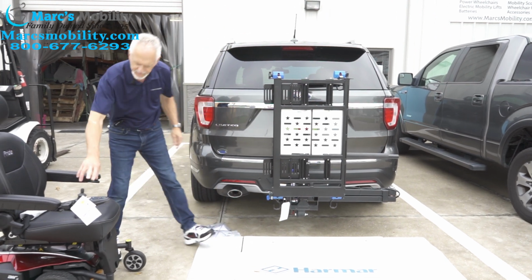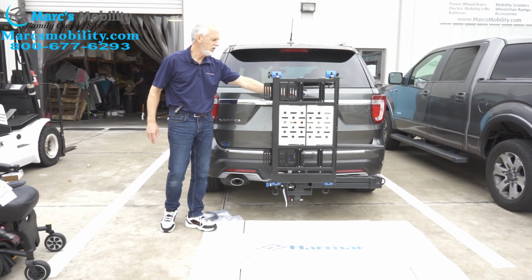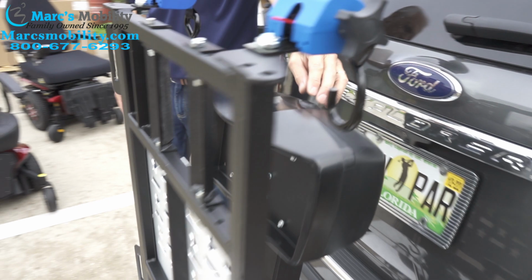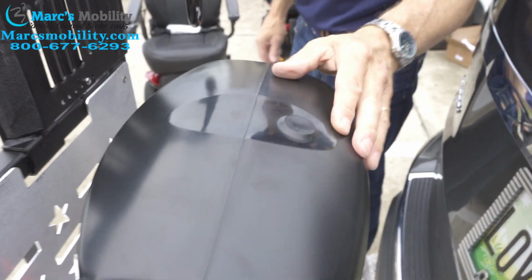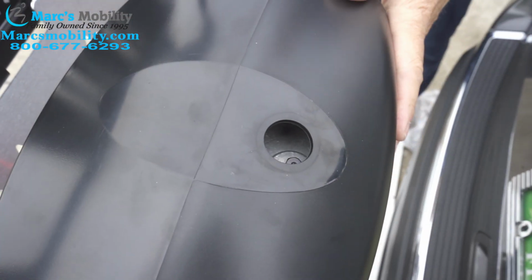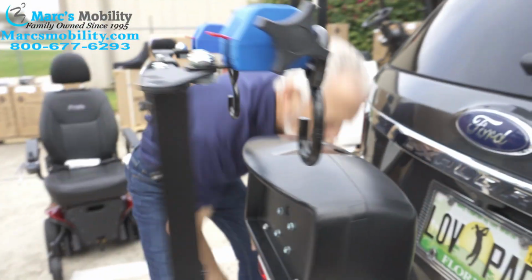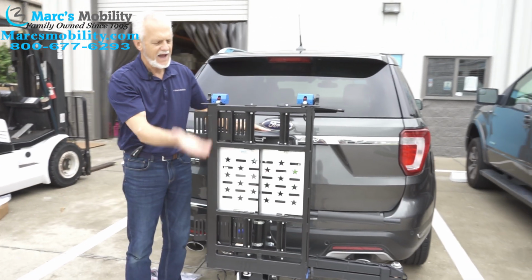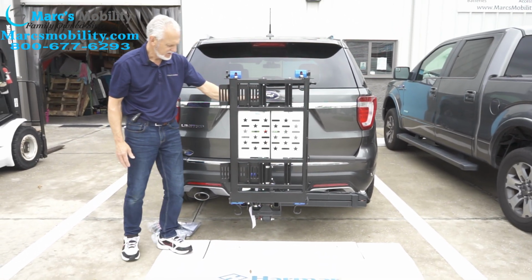Also with this lift, you have a backup right here. On the top of your lift, if you look over here, you'll see a little plastic cap right here. And you take that cap off and you can go in here with a 3/8 socket and you can crank it manually. So if you ever had a problem with your lift or your battery on your car is dead and you need to have the lift go up, you can crank it manually with a 3/8 socket wrench, okay?